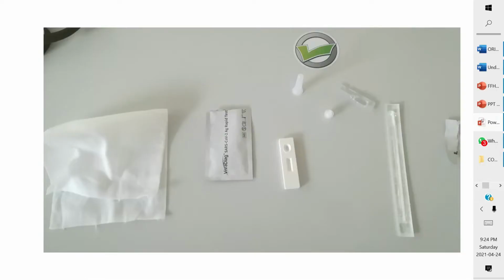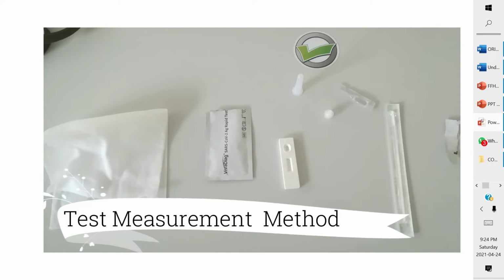Let me explain the step-by-step procedure of this. In a class self-test, you should sit at a table which is far away from a student, or you can say keeping social distance appropriately. Open the kit, utilize the cloth. You need to clean the surface area with this piece of cloth. Then you have to open the SARS-CoV-2 AG rapid test kit.